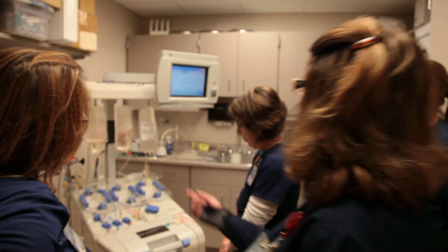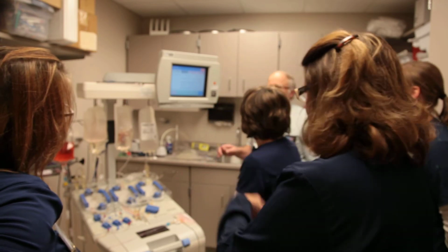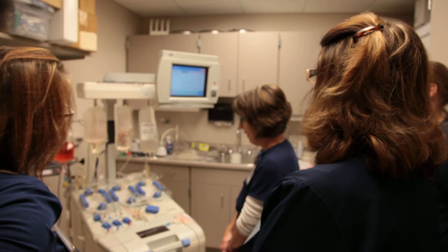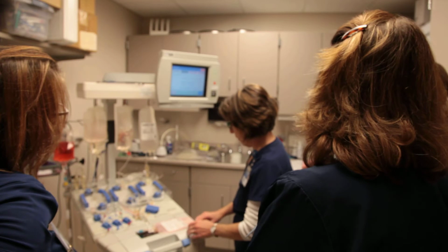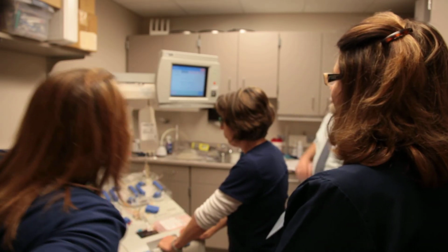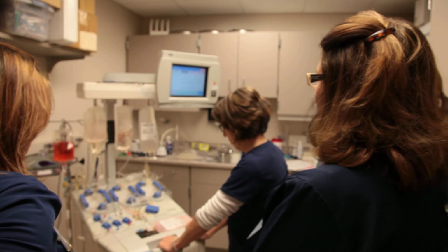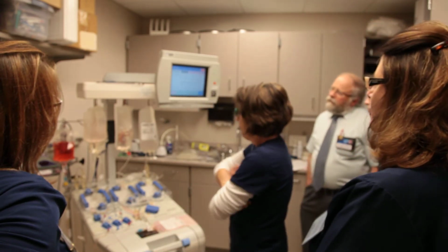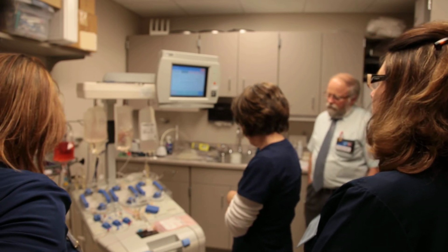Okay, so then you'll see after it pumps the 85 mils, it's normal for the centrifuge to go down like this, so don't get spooked. I think I even put it in the SOP, because I know people panic the first time they use it. Where you see it's ghosted out, it's gonna come up and be lit after the 85 mils pumps through. So you can stop it at any time if for some reason.